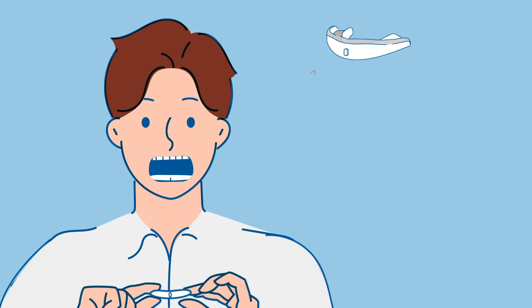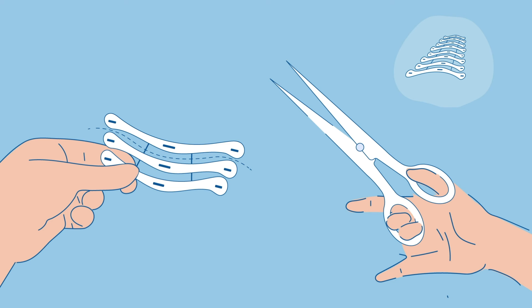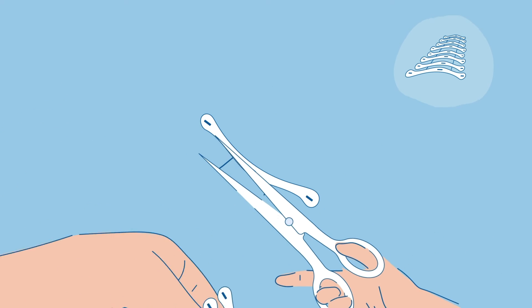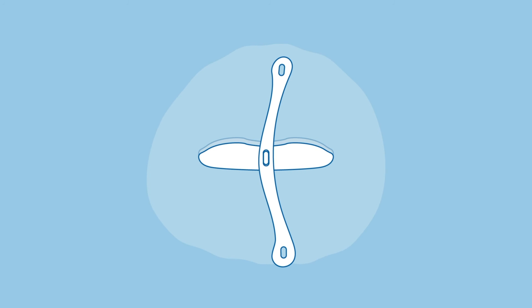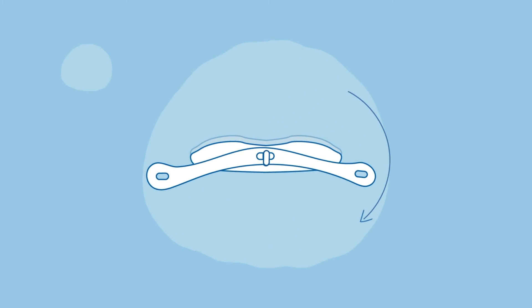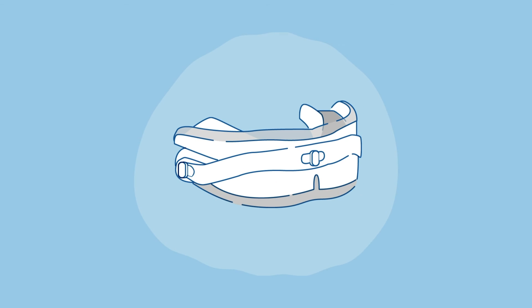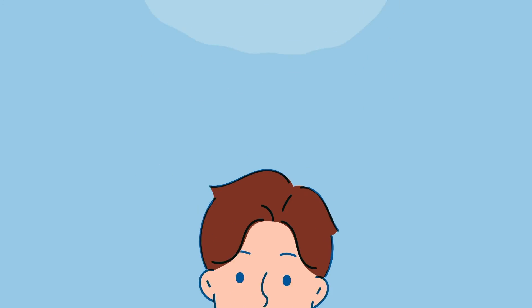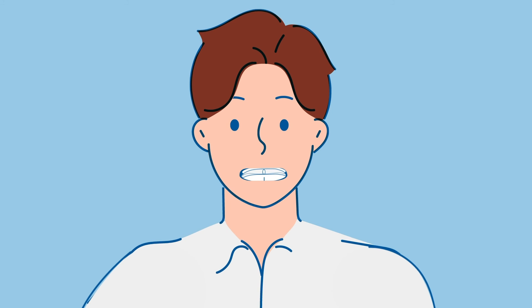Remove the upper mouthpiece, then the lower mouthpiece. Choose a flexible strip according to the instructions and cut off the ties to the edge of the strips. Place the strip vertically on the hook of the upper mouthpiece, then rotate the strip a quarter turn. Place the strip's holes over the hooks on the lower mouthpiece, then join the mouthpieces together. The device is ready for everyday use. Every evening, place your orthosis in your mouth to enjoy a peaceful night's sleep.